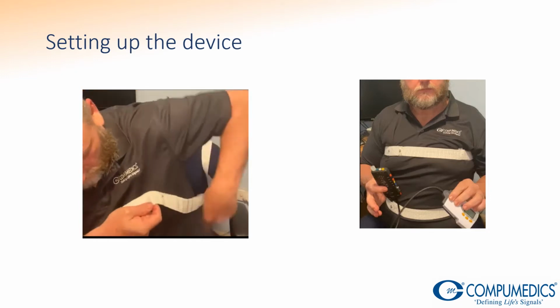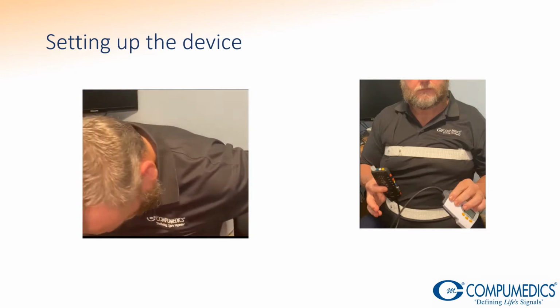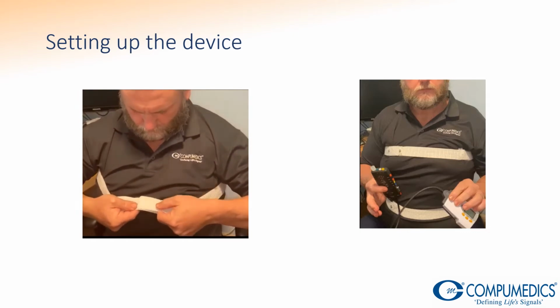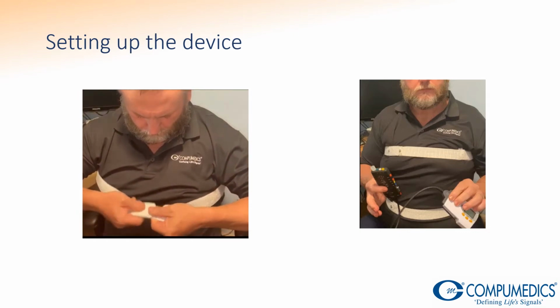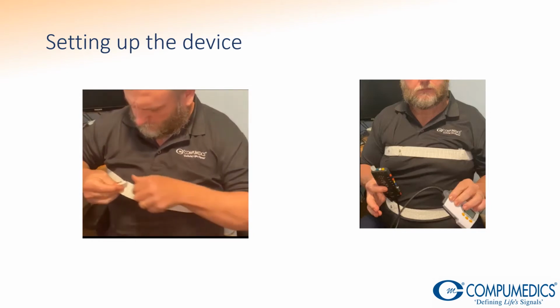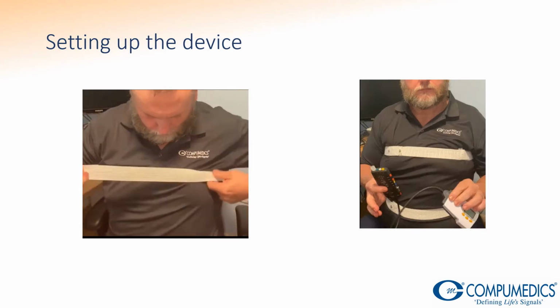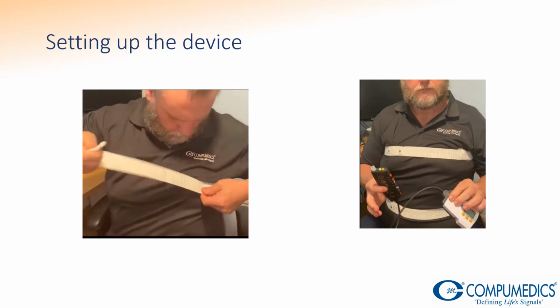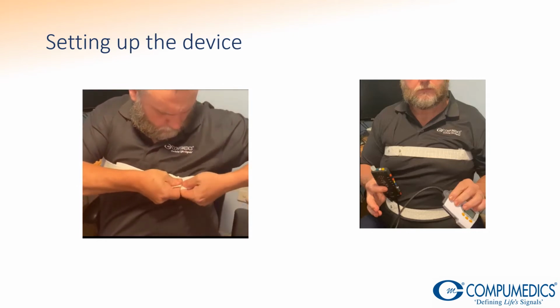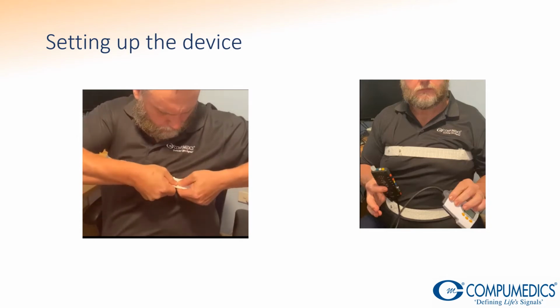The belts you use may vary. These are the disposable white bands that have a small metal clip in them that you can feed through the band. They have Velcro attachments, and also there's a plastic clip that helps to secure it when you fold it over to tighten it. The black bands have a single strap that feeds through and clips onto the other side of the belt.